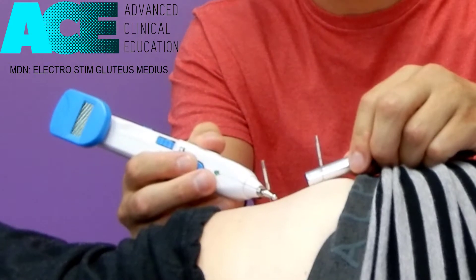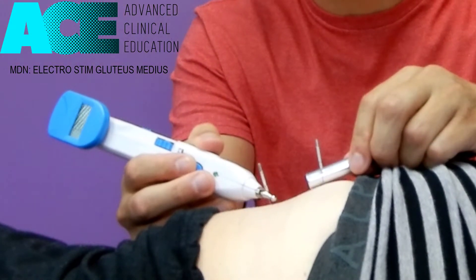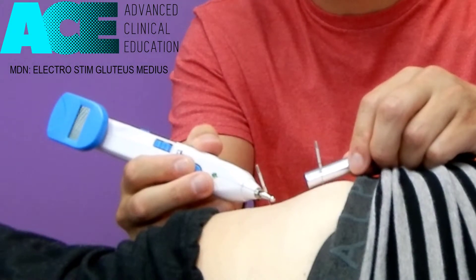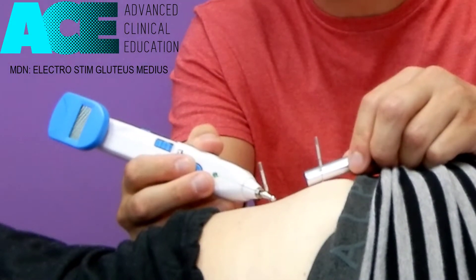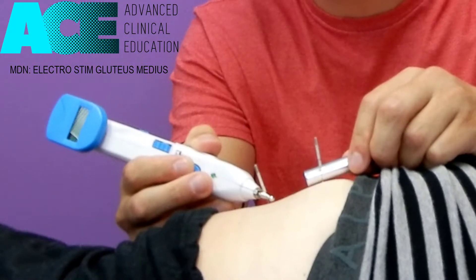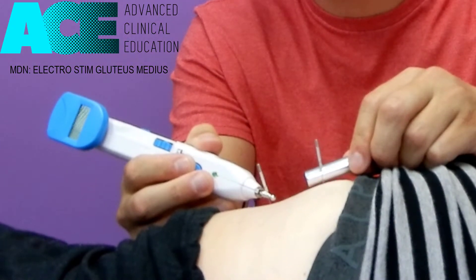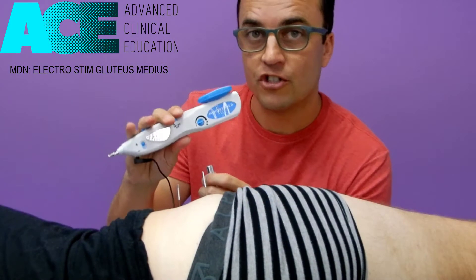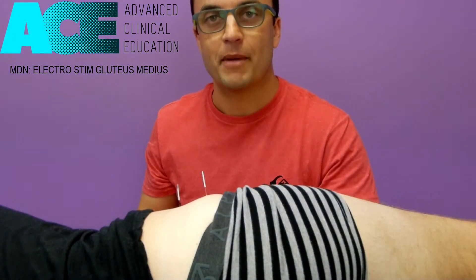And you can see muscle twitching there as it contracts. It's a great way to treat the trigger points but also reactivate that glute med to help improve the pathway for function. It's one of many ways that we can use electro stim with dry needling as part of our manual therapy treatments.